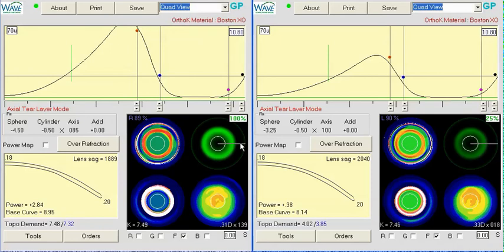What I mentioned in the beginning about theoretical multifocal lenses, something that I probably would experiment with at some point, but I haven't found a good patient to do that with. And if you do head down that road, I'd like to hear how your results are. So hopefully this will help at least take care of this current patient.